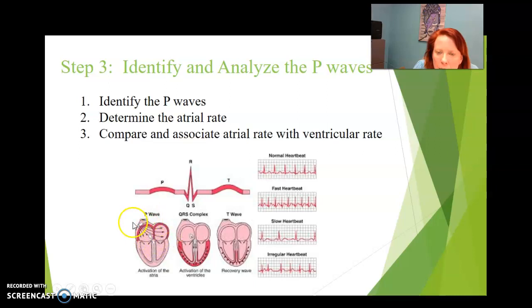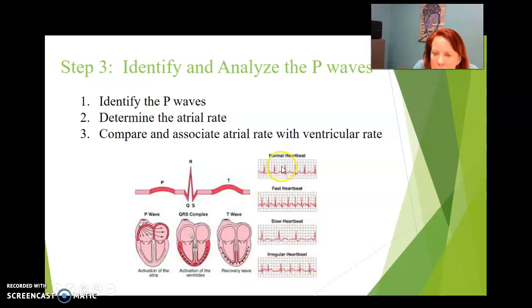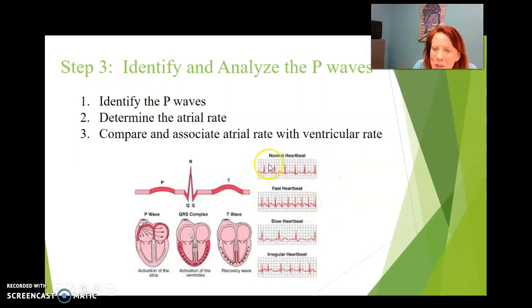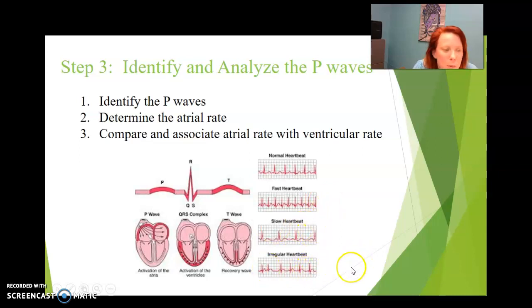Here is the P wave right here, and here is the QRS wave right here, and here's the T wave. So this is a normal heartbeat. This is fast. This is slower. And this is irregular. If you can differentiate between these three and understand what I'm talking about, we're good. So this is normal, this is faster than normal, this is slow, and this is irregular.